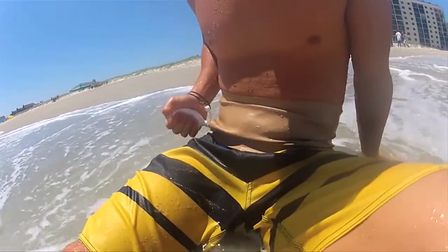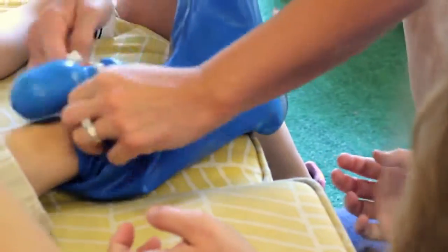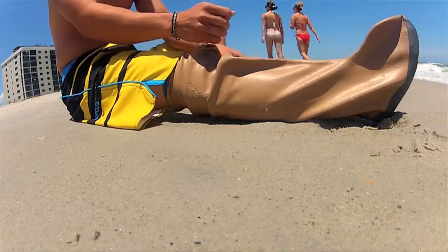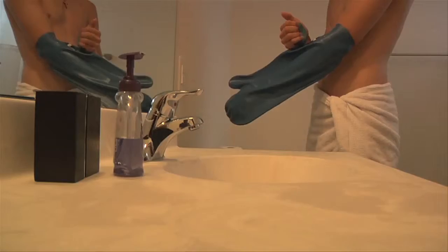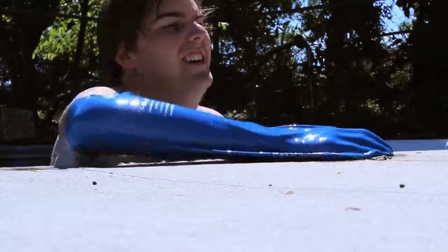Our DryPro cast and wound protector is perfect for any broken or sprained area in the arm or leg. Simply apply the DryPro over the affected area and, using the supplied pump, remove any excess air inside. This in turn creates our patented vacuum seal, which ensures 100% waterproof protection.